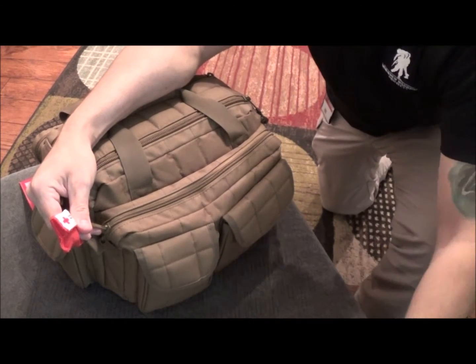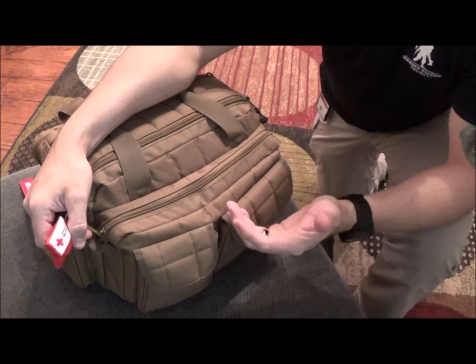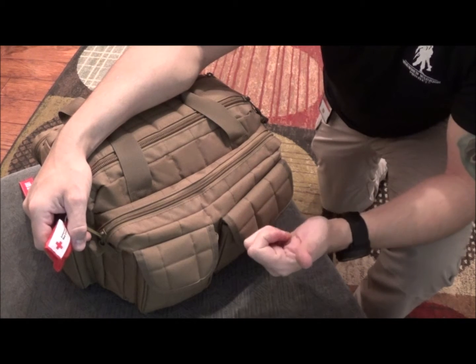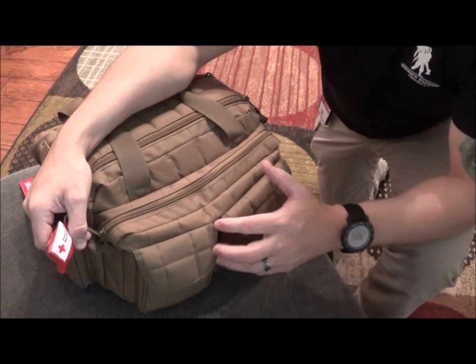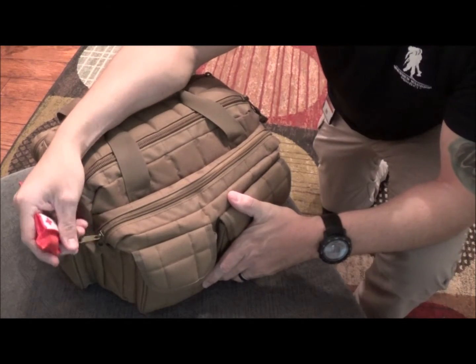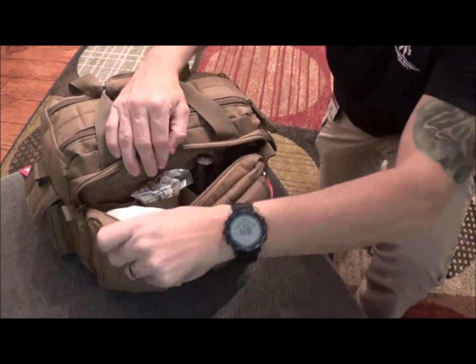So, you know, and granted, it just depends on the life or death situation. If you're trying to do CPR on a patient that has a lot of blood from some kind of accident, you're definitely going to want to protect yourself because you don't know what that person has been exposed to. So anyway, I also keep it on here just because it gives me access into this compartment a little bit easier. So let's go ahead and open this up.